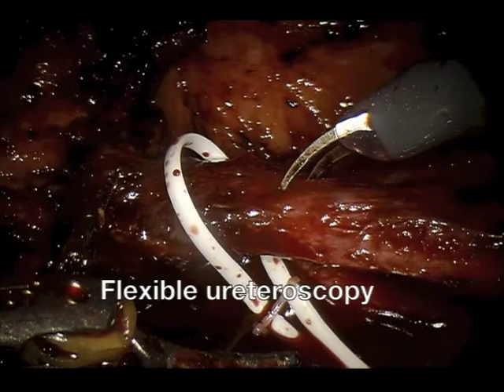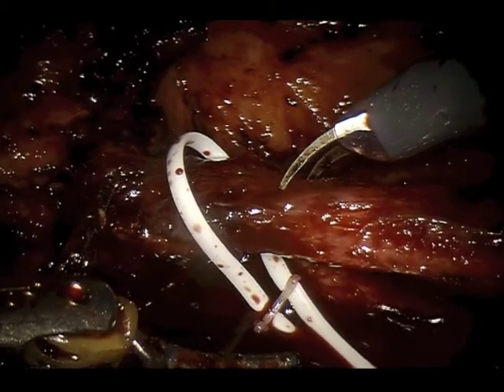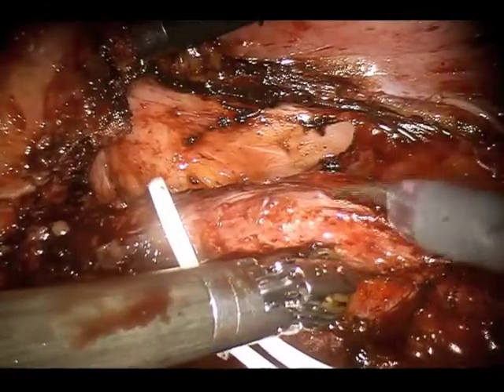Flexible ureteroscopy was performed to aid in identification of the diseased segment. The stricture was several centimeters in length, and the flexible ureteroscope met significant resistance at the stricture. The light of the ureteroscope marked the distal margin and was clearly visualized with near-infrared fluorescence imaging. A stay suture was placed to assist with retraction.